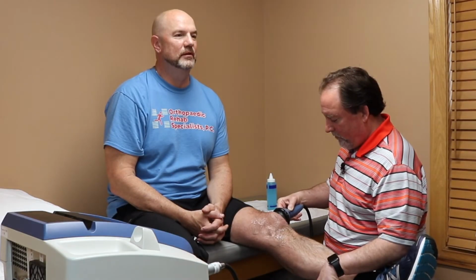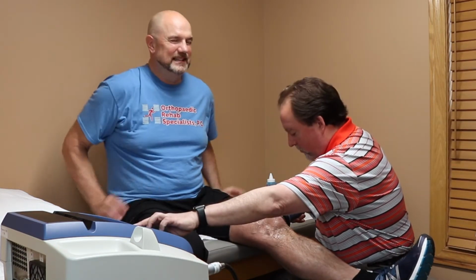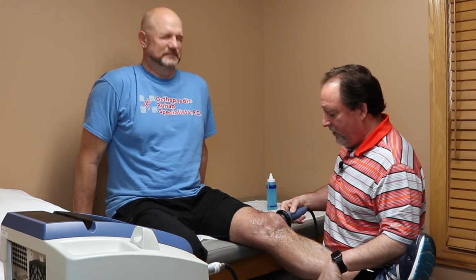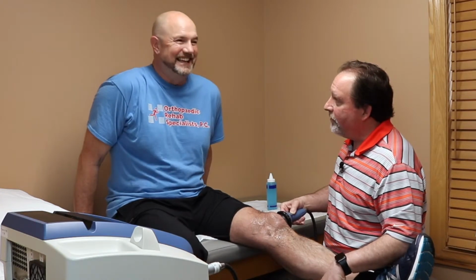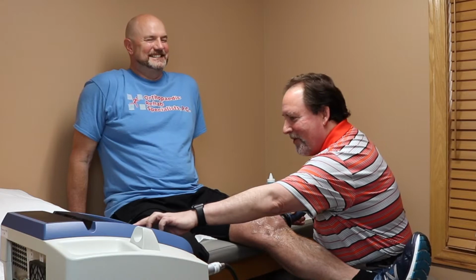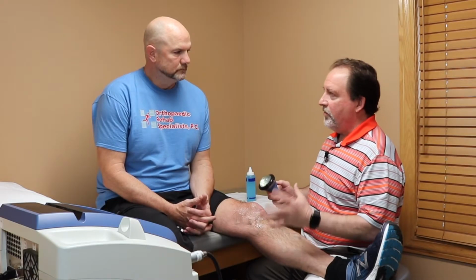What a powerful machine, though. Back that down just a bit. Wow. Is that good? I'm back down to intensity of 3, which is a grade school child level. Maybe we should go to 2. That's kindergarten. We're down to kindergarten child level.